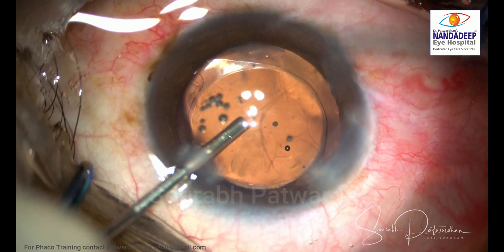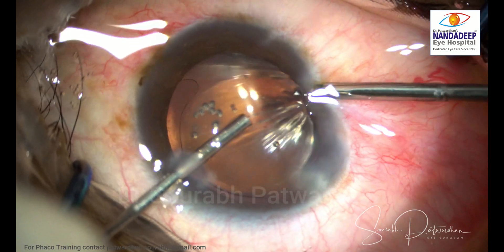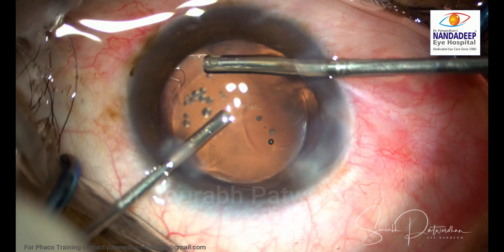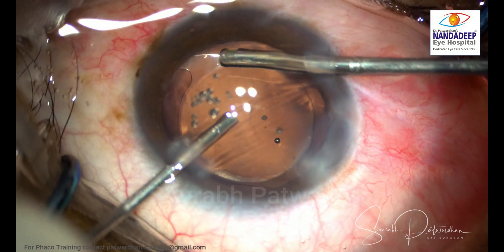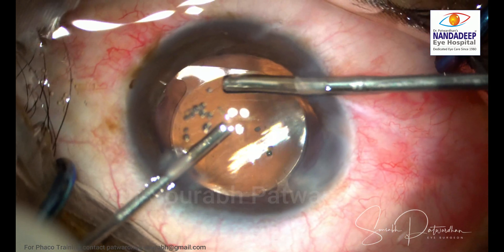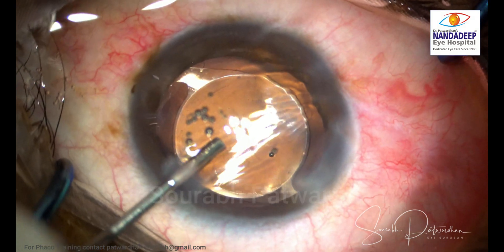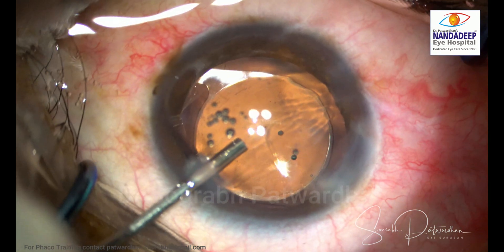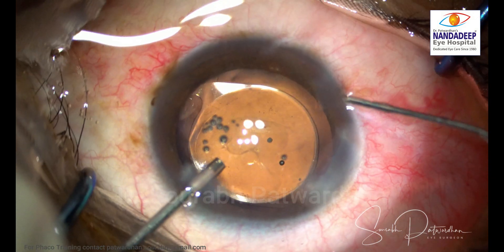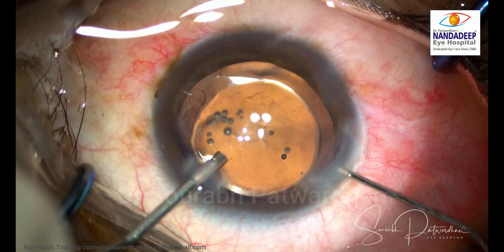I am staining the chamber with triamcinolone again to see if there is any residual vitreous. You can see just a few fibers remaining near the area of subluxation, so I went in with the vitrectomy probe in that area and cut out the rest of the vitreous in the anterior chamber. That's the end of the vitrectomy — I made sure there is no vitreous remaining in the anterior chamber.